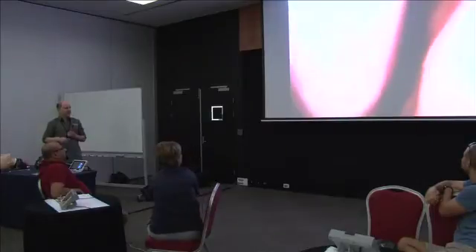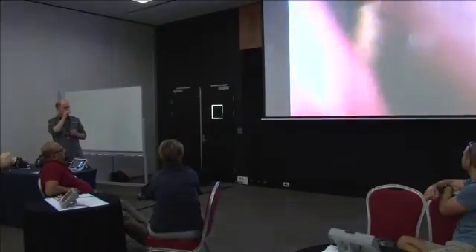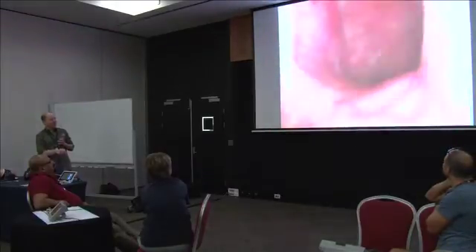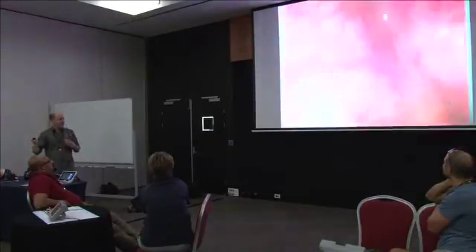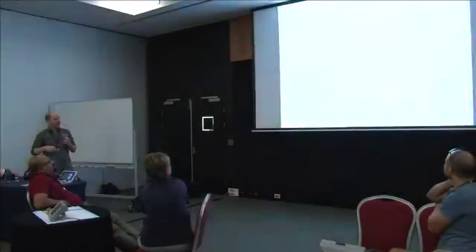The real trick to scoping yourself is operating a laser pointer while scoping yourself. Here on the right side we have the inferior nasal turbinate — here's the inferior nasal turbinate, here's the septum, so this is lateral and this is medial. This structure is very sensitive and will bleed, and people pass out when you hit it, so you don't want to hit it. I'm going alongside the inferior turbinate to get to the back of my nasal pharynx and introduce you to the eustachian tube coming in from the side. Dr. Harris, my ENT colleague, mentioned that if you flick the scope you can actually get to the other eustachian tube.